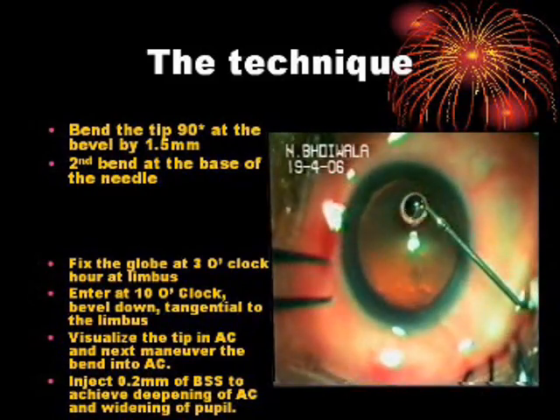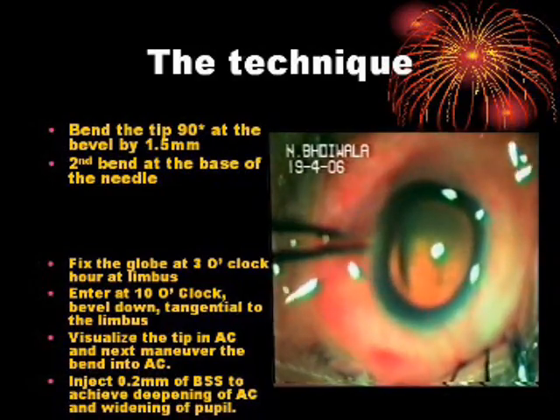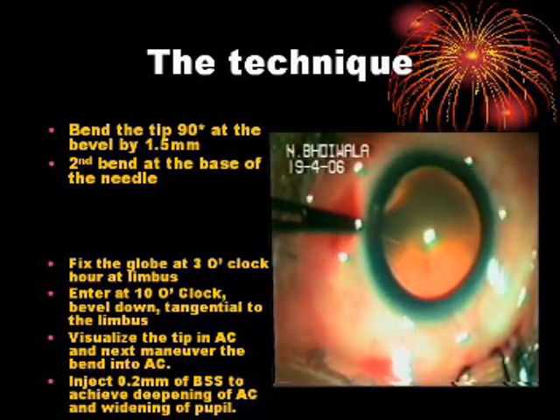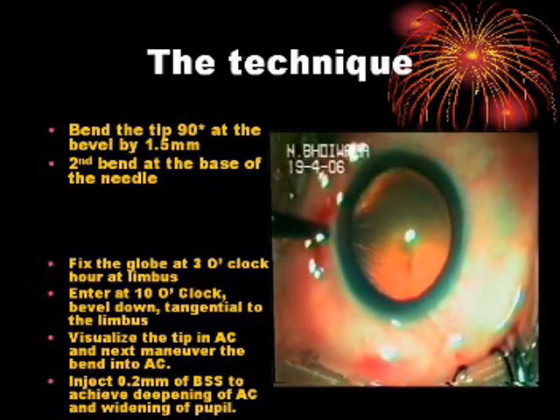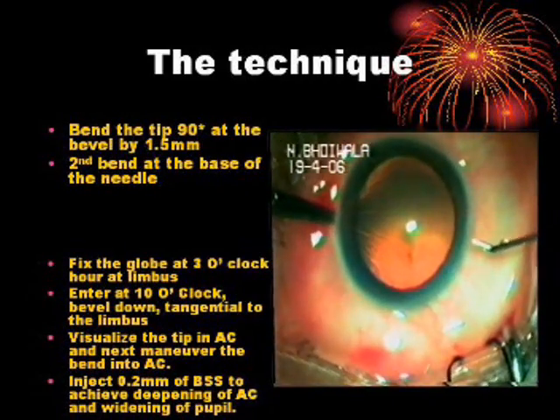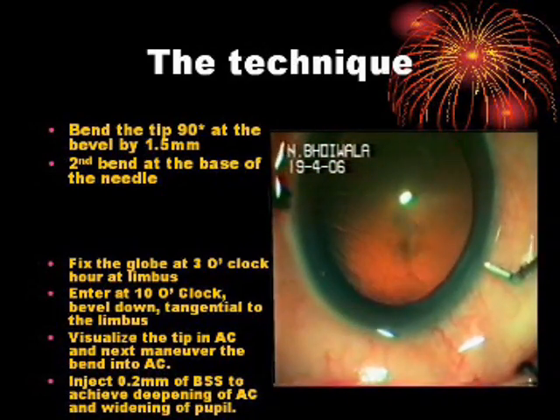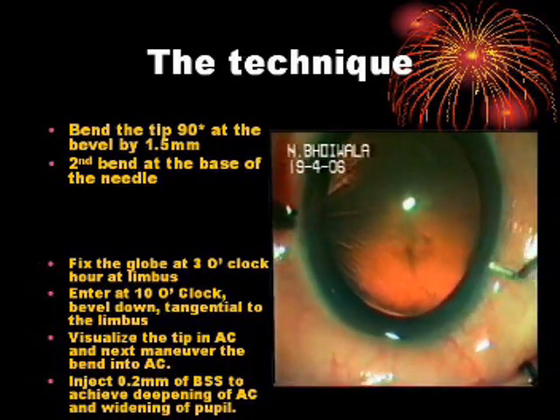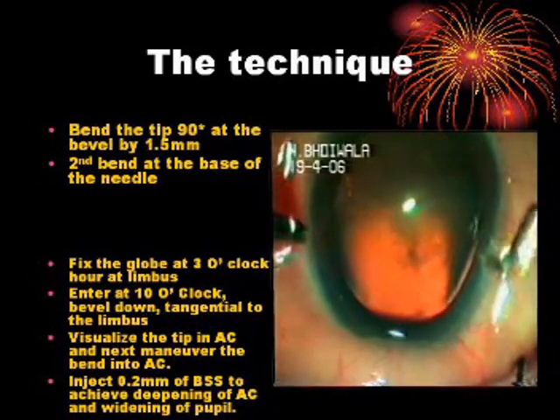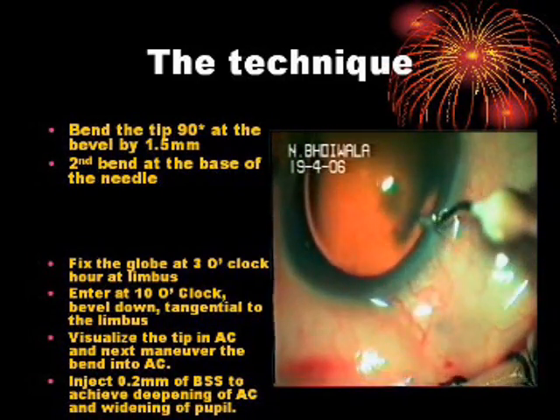Fix the globe at the 3 o'clock position at the limbus. Enter at 10 o'clock, bevel down, tangential to the limbus. Visualize the tip in the anterior chamber, then maneuver the bend into the anterior chamber. Inject 0.2 milliliters of BSS to achieve deepening of the anterior chamber and widening of the pupil.